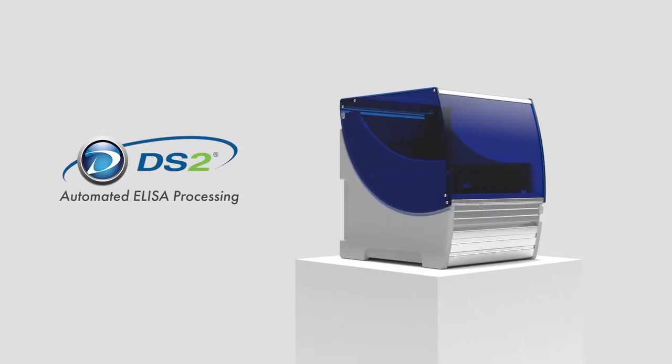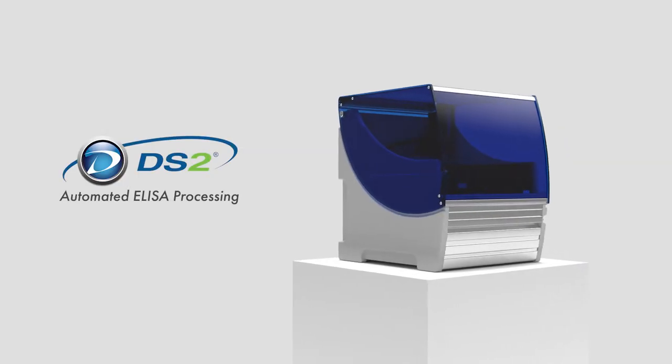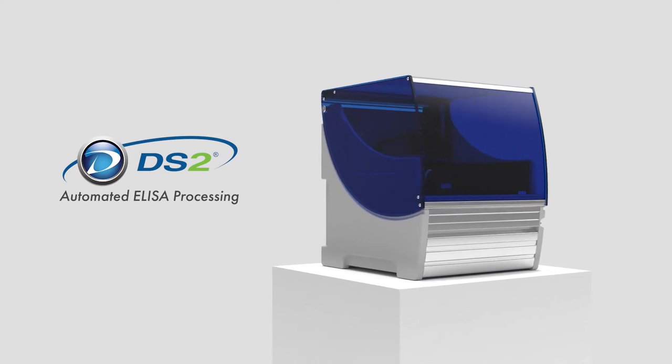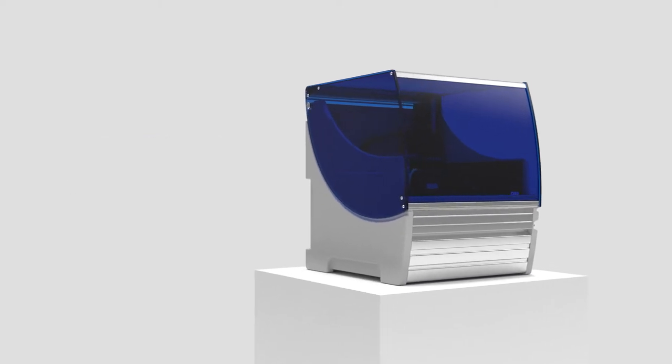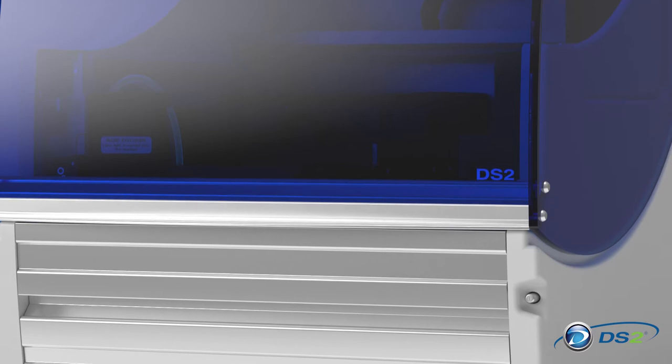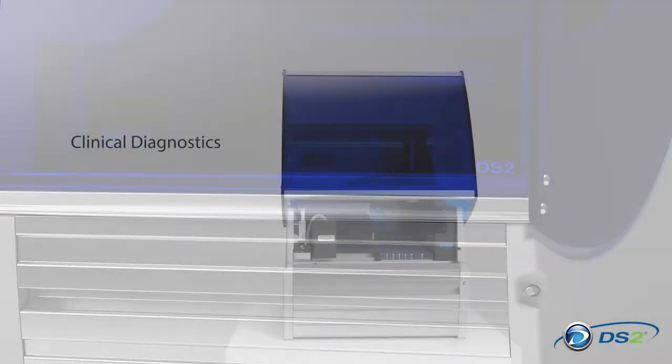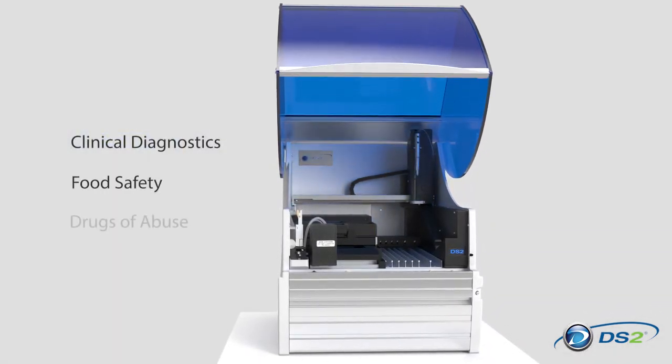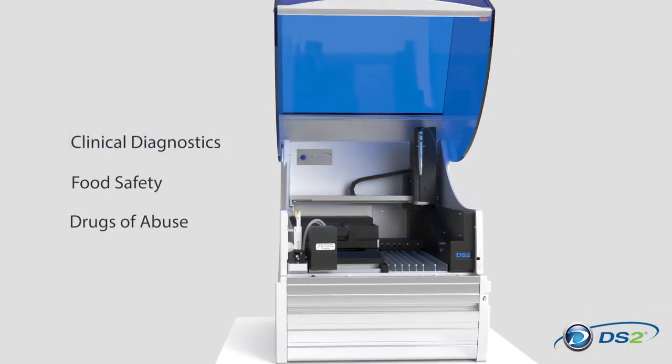The Dynex DS2 is a compact, fully automated two-plate immunoassay processing system designed for virtually any ELISA application, from clinical diagnostics to food safety to drugs of abuse testing.